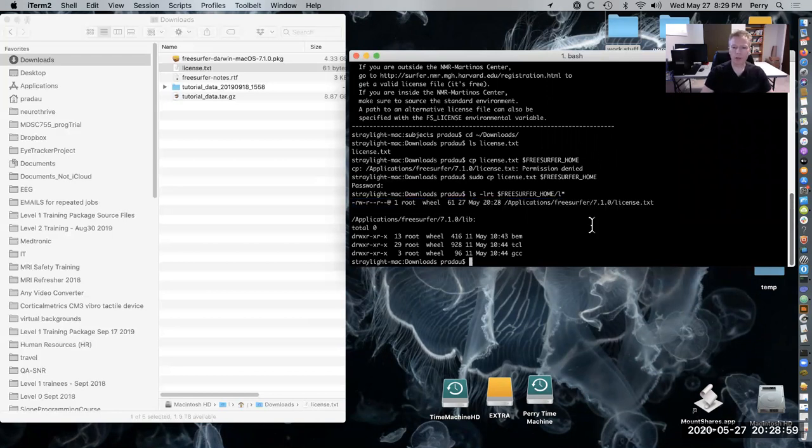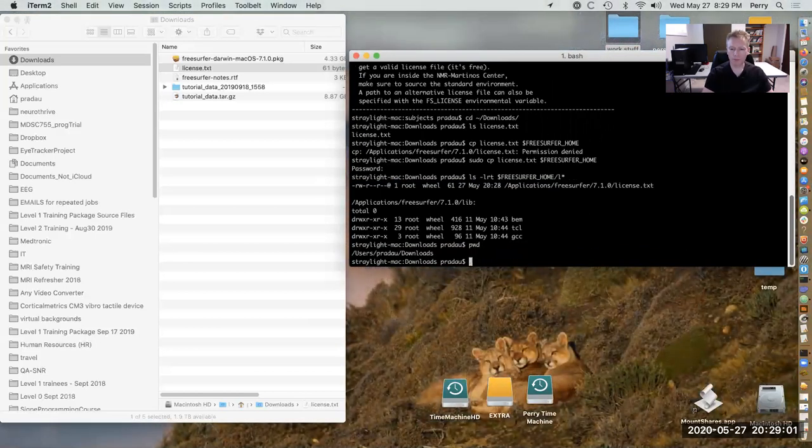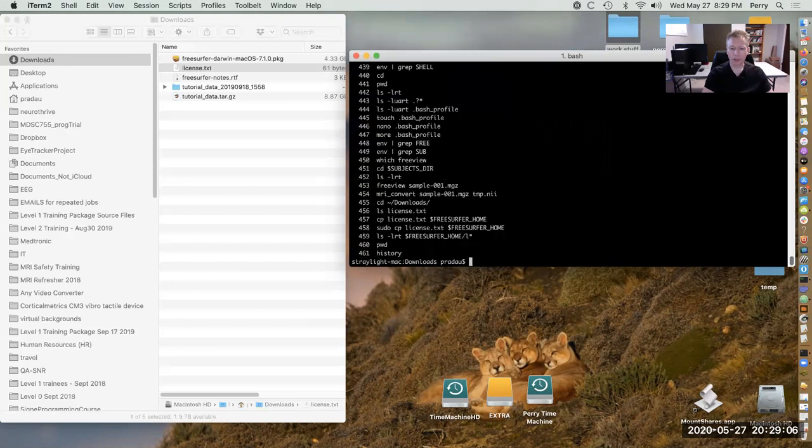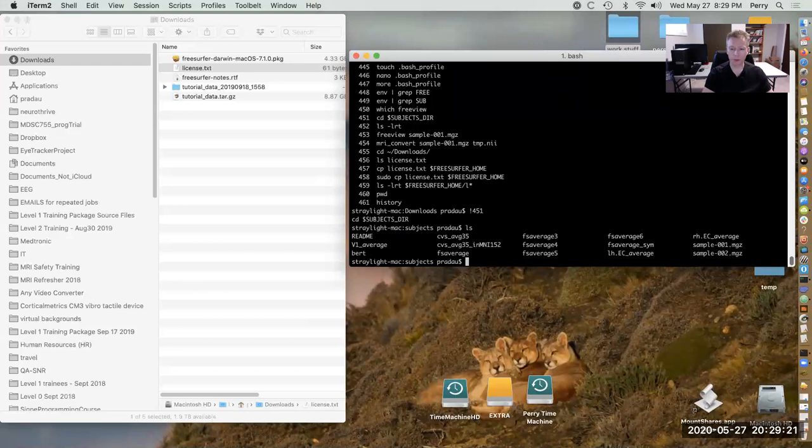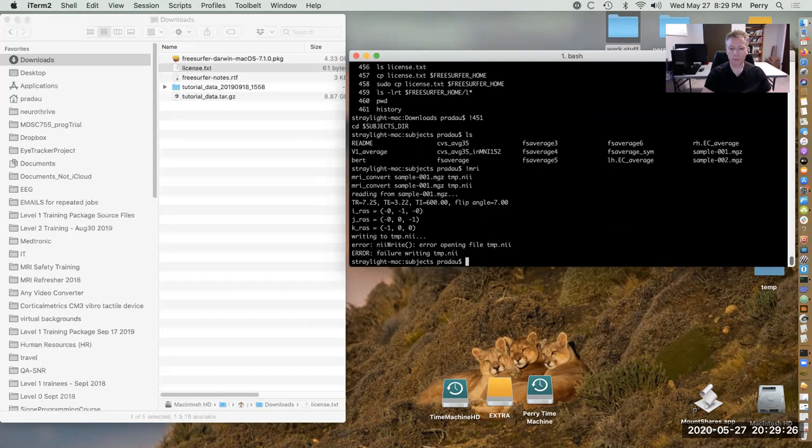So I'm hoping that my previous command works, but I have to be back where I was. So let's see. In my history, I've already done this, so I'm just going to use that. Notice in my history, line 451 is the one I want. So I'm just redoing that. And if I look where I am, yes, looks good. So I'm going to run the mri_convert command again. Aha. So this time, the license file is not an issue.